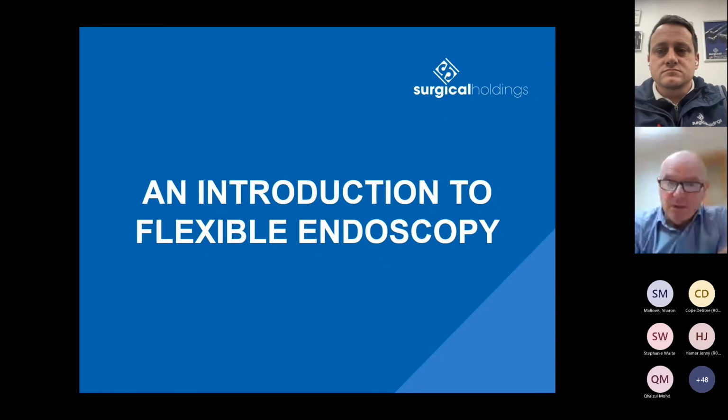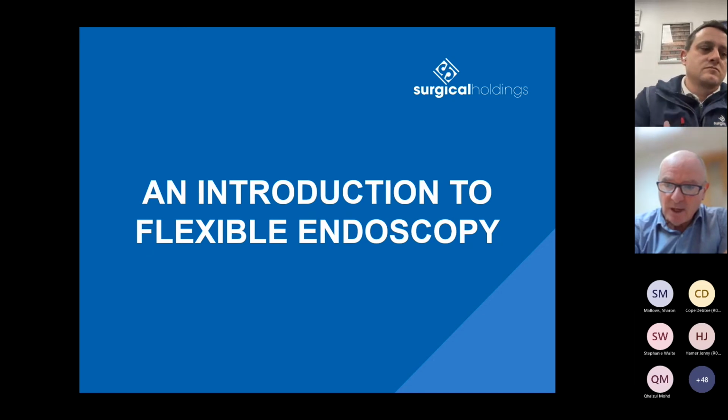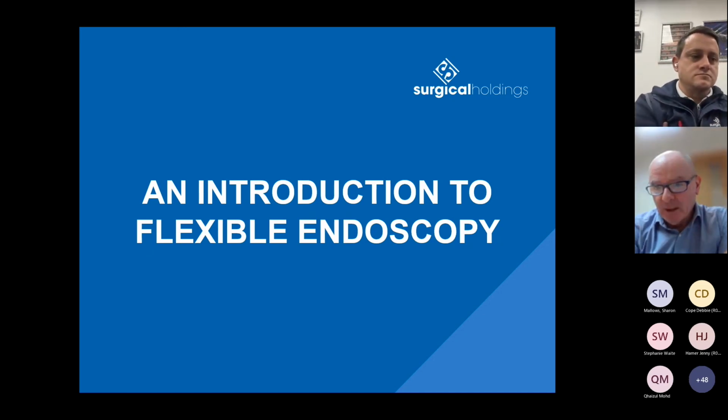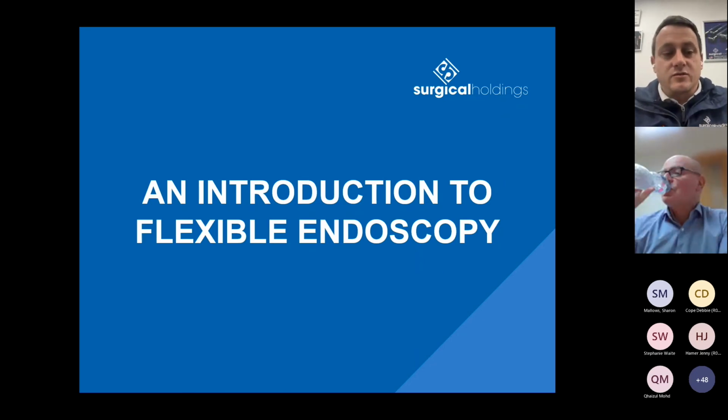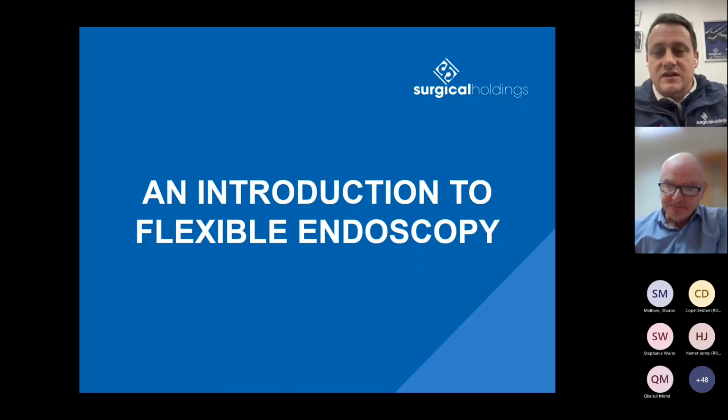To me, the fundamentals are the balance between the performance and the cost. And the other factor that we haven't talked about is obviously the green aspect. There's more and more emphasis on the green ramifications, and clearly if you've got something you're just throwing away, that's not very green. But equally, I'm sure if there are SPU people on the call, they'll have arguments as to why SPU is the best. Yeah, and I guess if you're taking those materials and then you can recycle them, and perhaps they're then used to make something else, then that changes it a little bit.